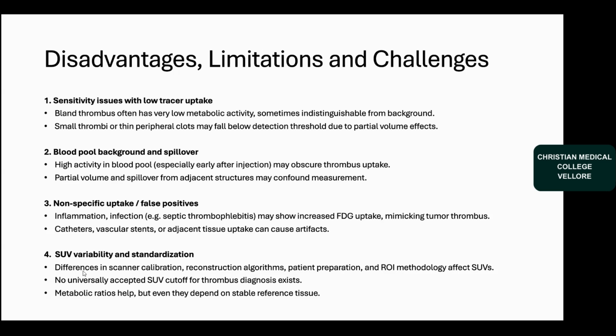All these can change the SUVs. There is no specific SUV cutoff, but from the studies, 3.5 might be a cutoff that helps to differentiate more specifically.